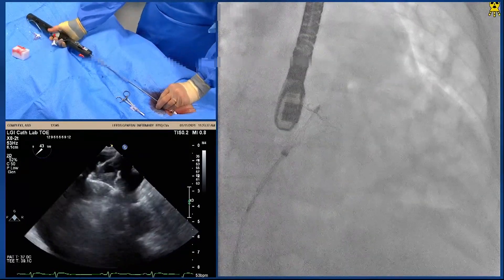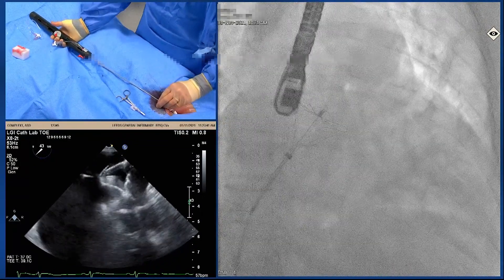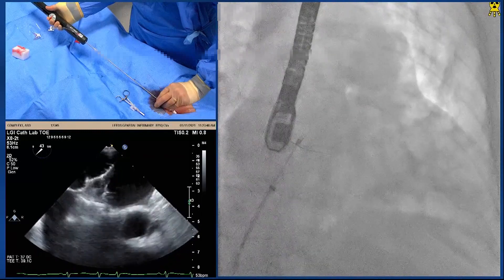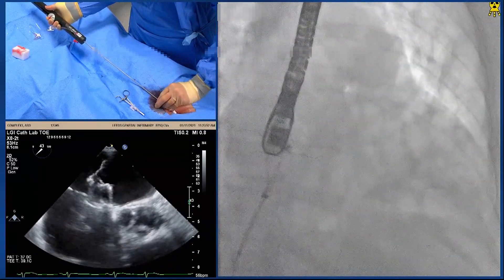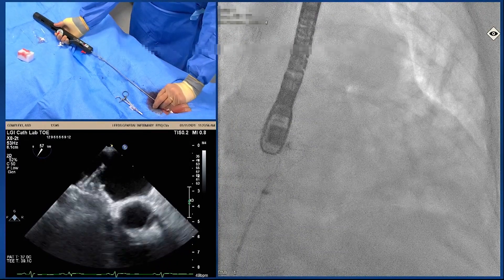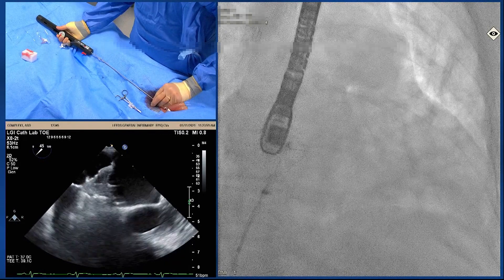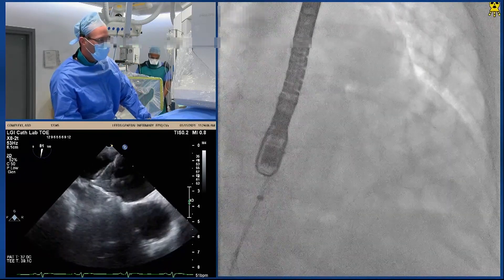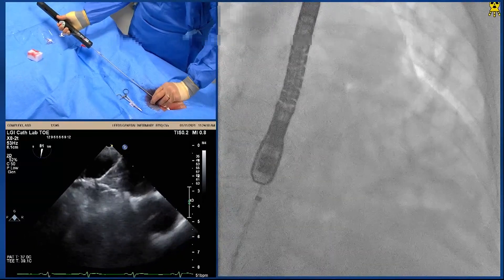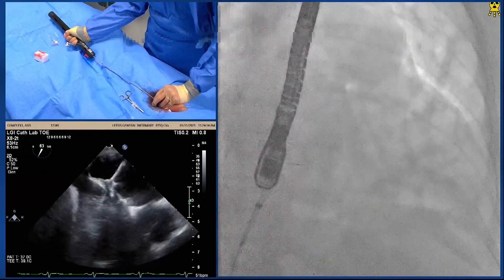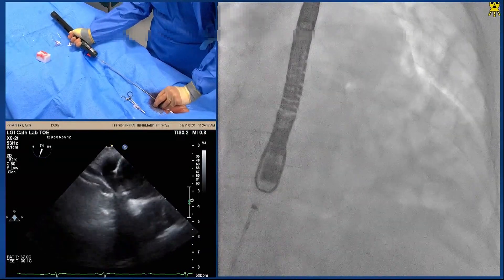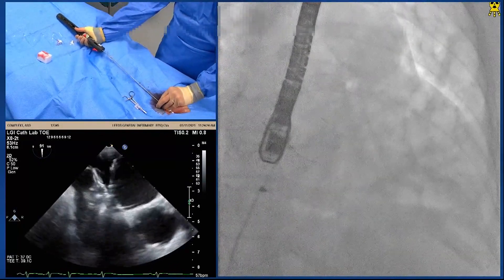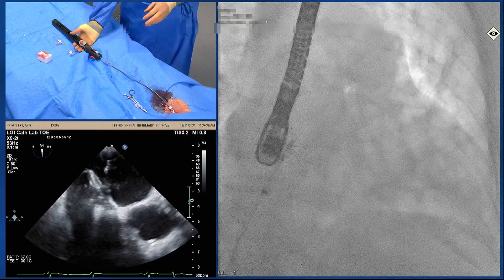We come to a soft cue which tells us that the left disc is fully formed. Then we bring the device into the defect until we see the left disc start to cup — nicely against the septum. The aortic rim is nicely opposed, but the inferior rim is not well opposed, so we need to come back some more, a little more tension. There's cupping now. So I can bring off the waist of the device and form the right disc, then push forward to release the tension on the septum. The device is deployed.